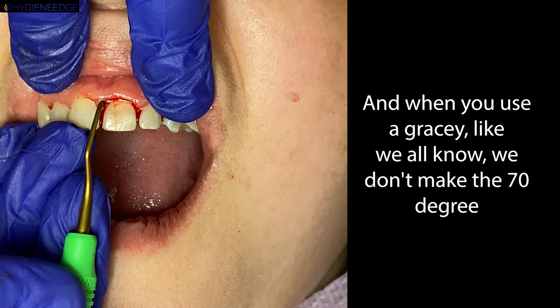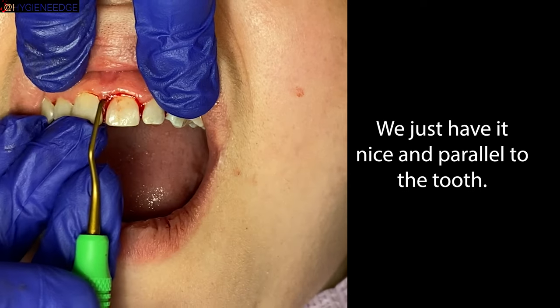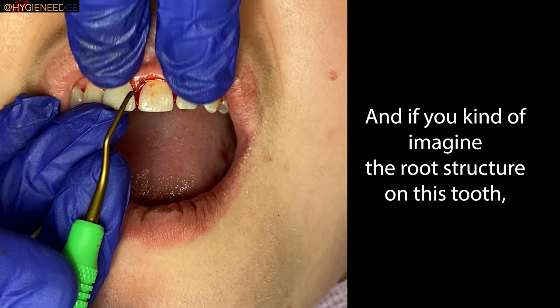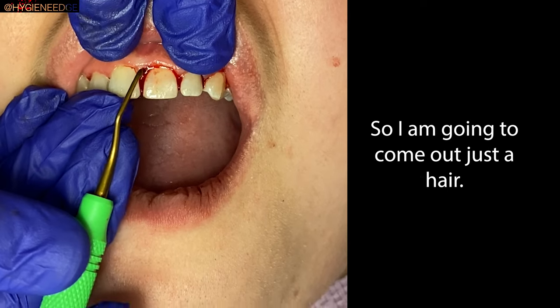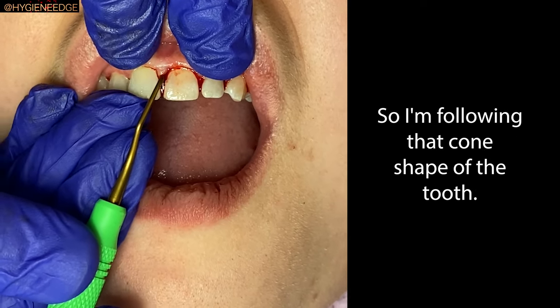When you use a gracey, like we all know, we don't make the 70-degree angle — we just have it nice and parallel to the tooth. If you imagine the root structure on this tooth, it's like a candy corn or a cone shape. So I'm going to come out just a hair so I'm following that cone shape of the tooth.